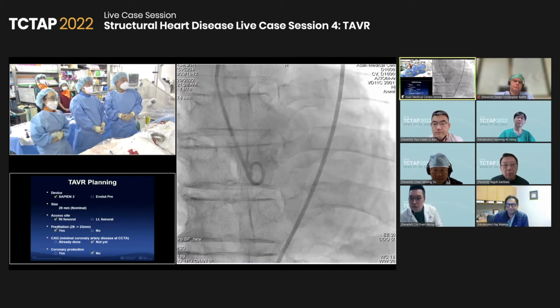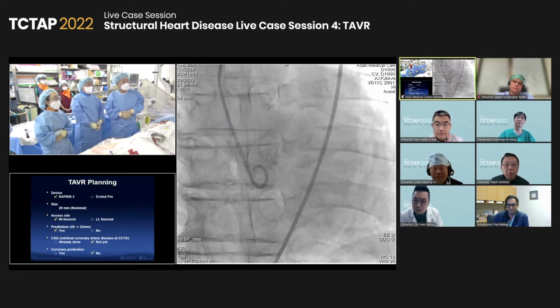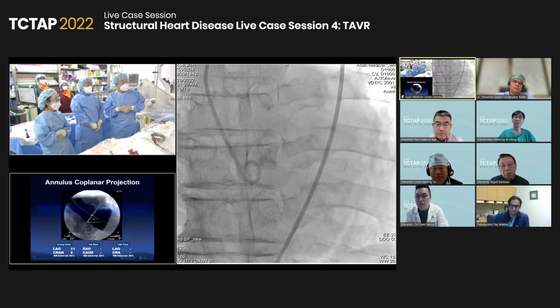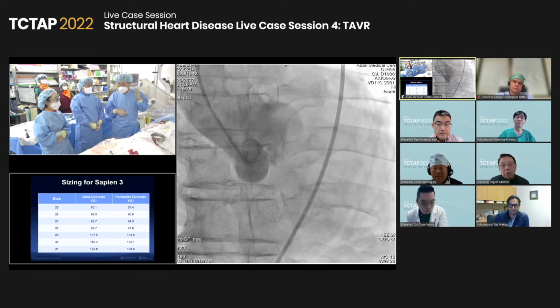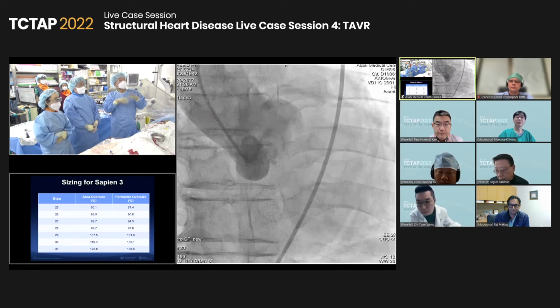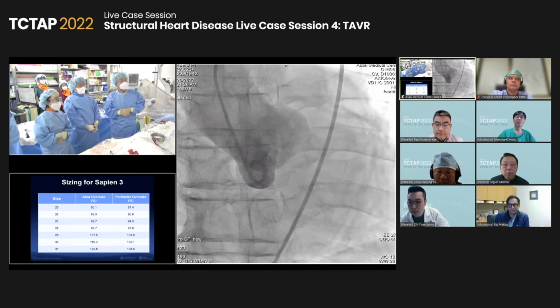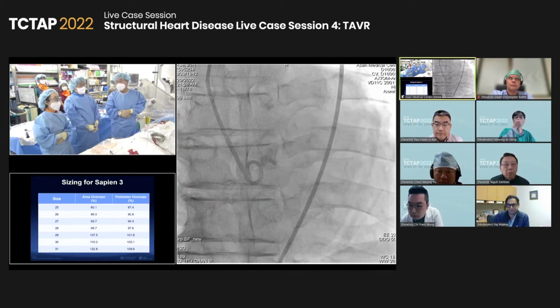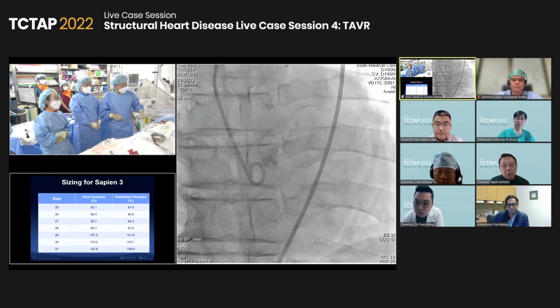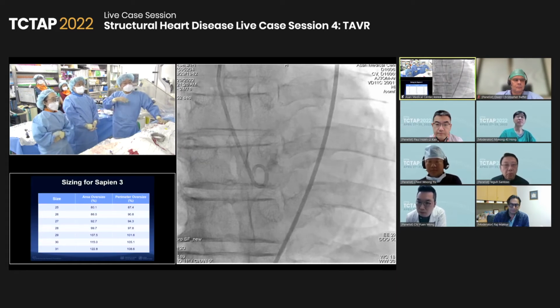Right, the case has a relatively low STS score. However, the echocardiographic findings suggest a rheumatic origin of valve destruction, with AS and severe AR components, right? You have already shown the CT algorithm, our own algorithm. Would you show us again? So, Dr. Hong, Rajesh, would you discuss?